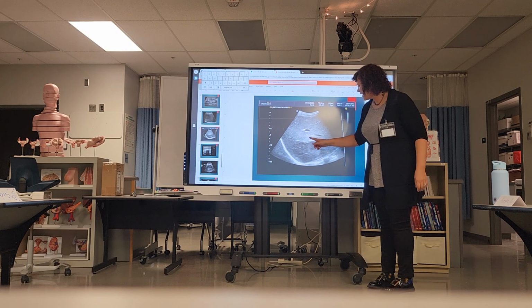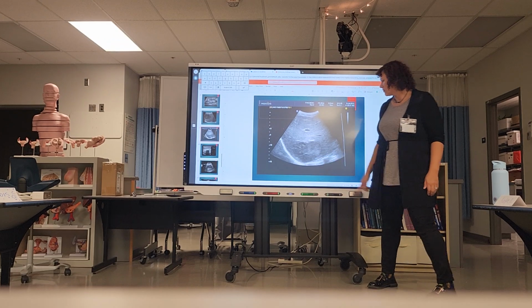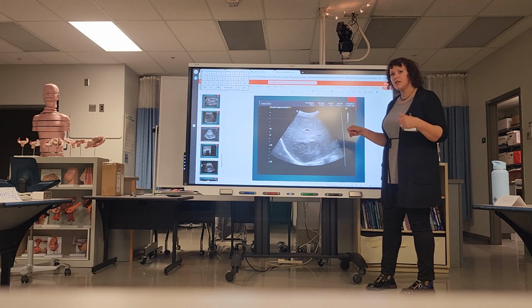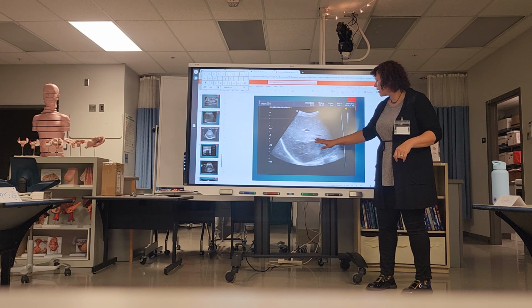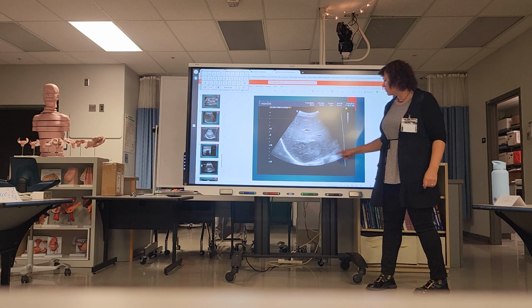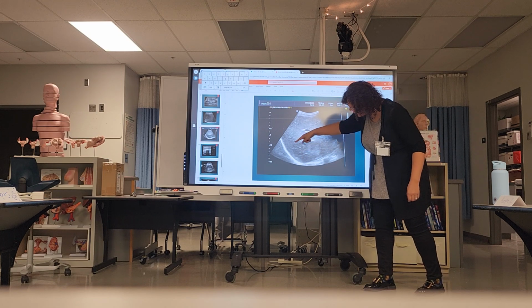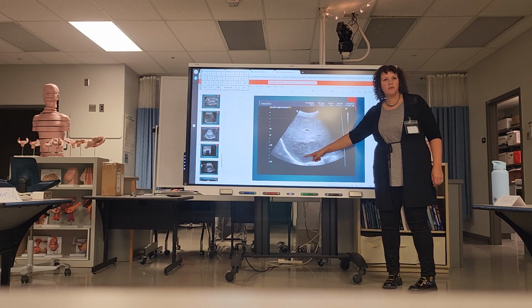Okay, so what's the echo texture here? How would you define the echogenicity? Isoechoic. Barely high. And say hypo. Yeah, so this is hypo, barely, it's just a touch more hypoechoic than the liver tissue out here. So what about the borders? Irregular, yeah. So I would say lobulated and irregular. You can see the border here, but as we get out here I no longer am making out a very well circumscribed border.